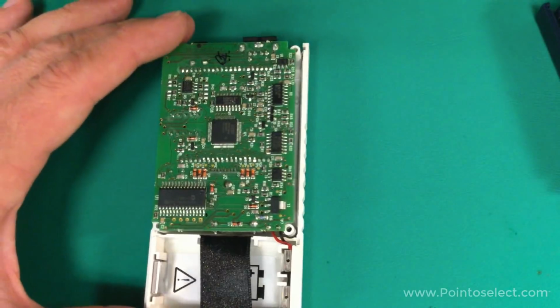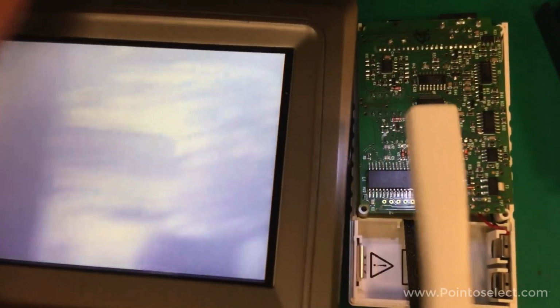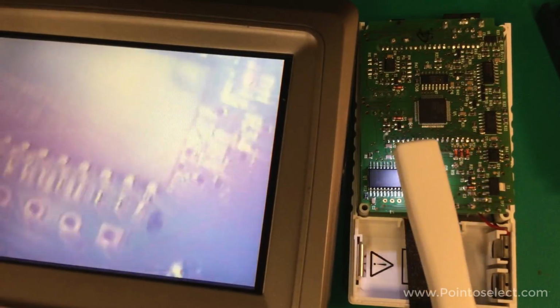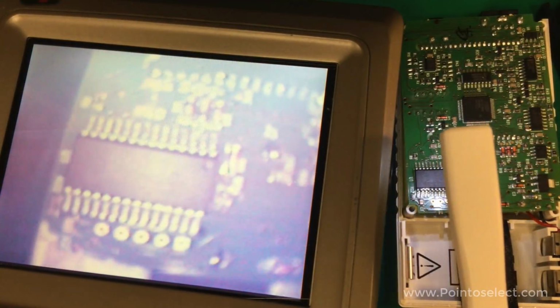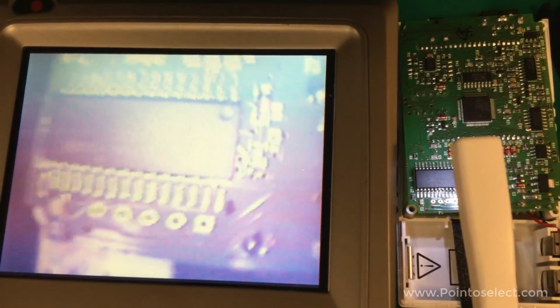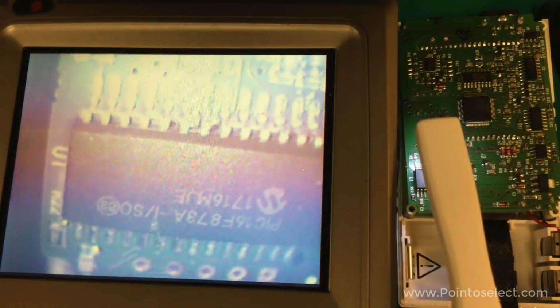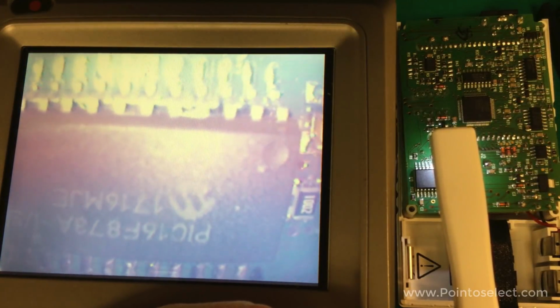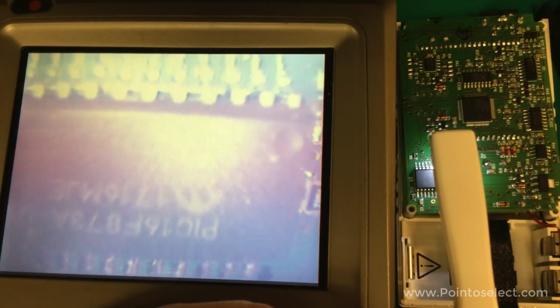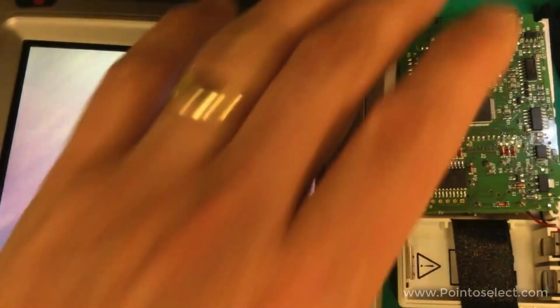Let's take a look at the, there we go. All right, so get that in view and then see if we can get a look at that microcontroller. What do we have here? Okay. So it's a PIC microcontroller. That's a family of microcontrollers, PIC 16F873A. And that's the brains of the unit. That's what runs the programming that makes it do what it does.